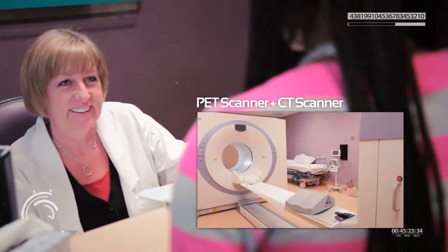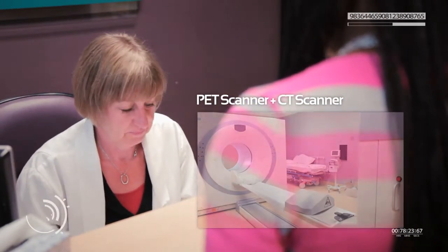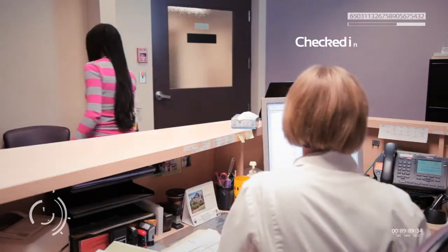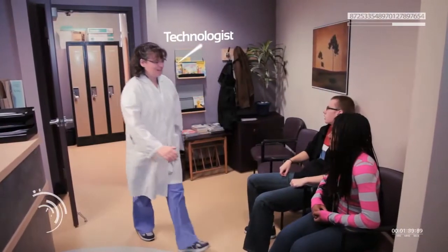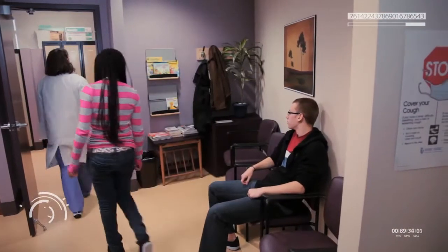The machine you see here is a PET scanner combined with a CT scanner. It is normally used to find cancer in people's bodies. I checked in with the receptionist at the desk and soon a technologist came to get me ready for the scan.